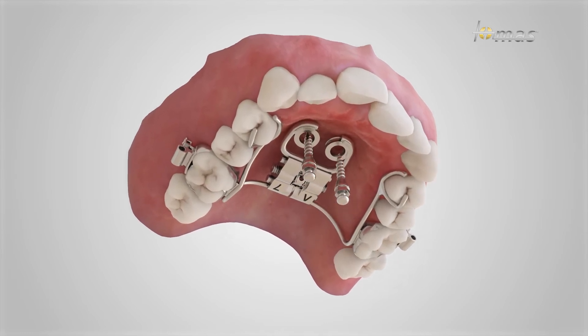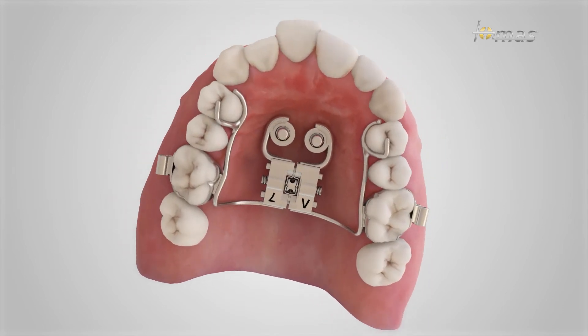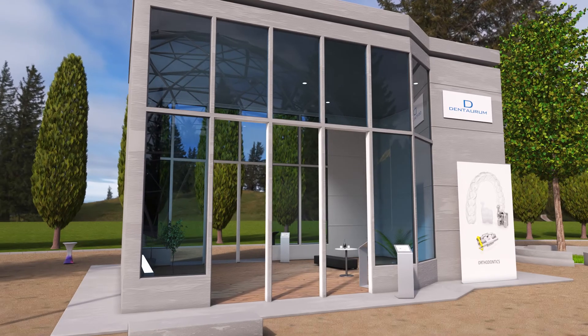The Thomas RPE islet serves not only as a coupling element between the Thomas pin and the hyrax expansion screws, but can also function as a guiding element during insertion.